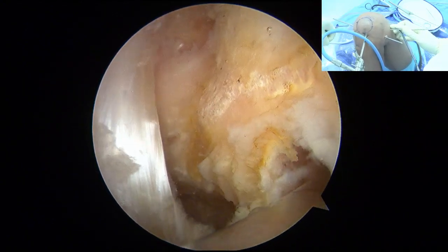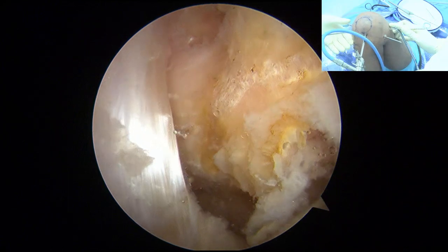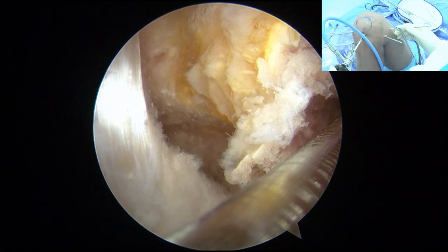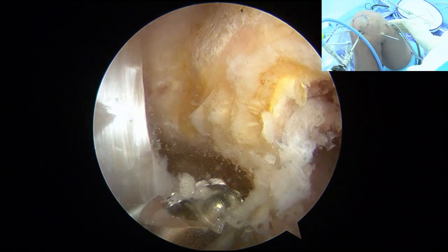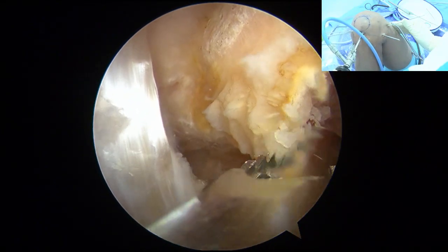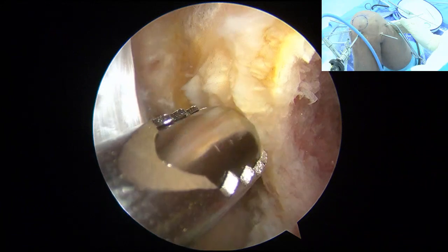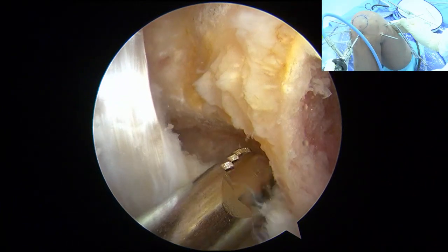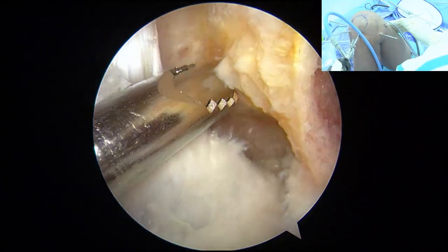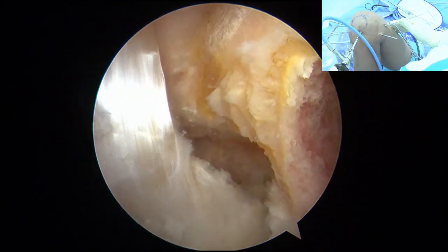And cross to the posterior, okay? So if you cannot make a big size graft, your position should be here. We call this the intersection of the ideal point, I-D-E-A-L, right? 那我们今天操作呢，就是按照刚才介绍的 I-D-E-A-L, ideal, 这个理想原则来做的隧道点。它呢在住院医师脊的下方，它比较靠下靠后，但是又不容易引起后方穿出。那如果移植物是比较细，不像今天的这么粗的话呢，是可以偏低。 Okay, so now you can see very well, right?